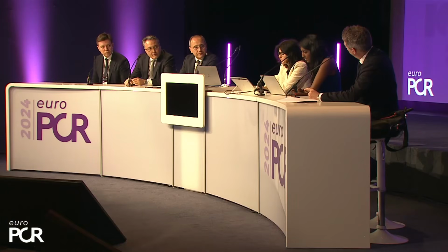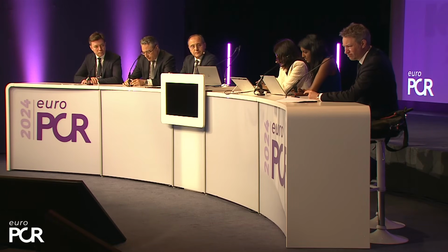Yes. So we have a comment from one colleague about the DCB discussion that we just had. Our colleague called Grigoris is saying, very calcified and with areas of recoil already, with DCB, so DCB may not be a good choice. So I think what probably the idea here is, what is a good result? Is this a good result for DCB? So when you're going to use DCB, you have to have, at the moment you put the DCB, a good result by angiography.